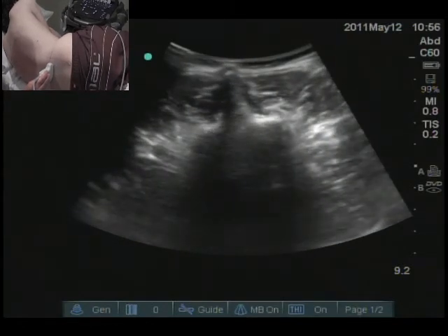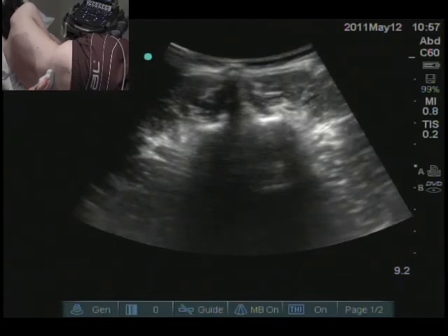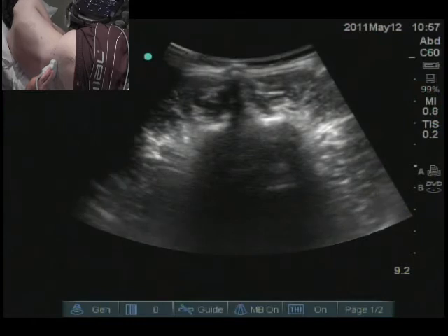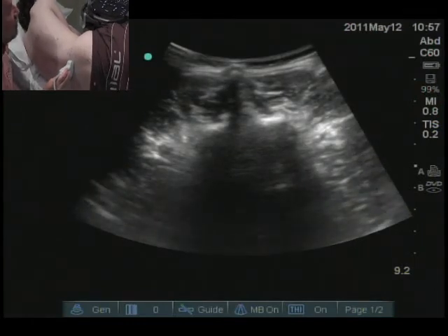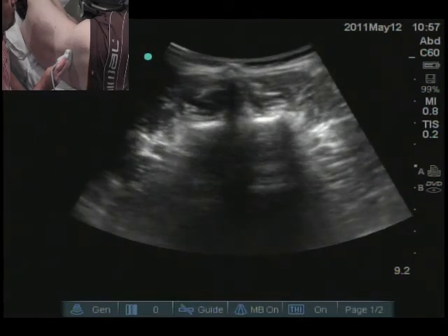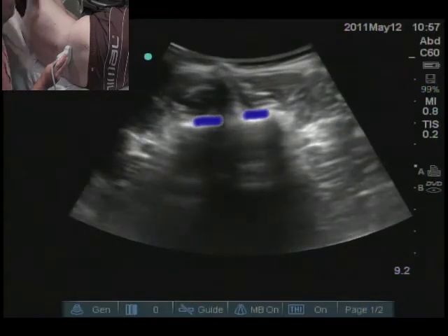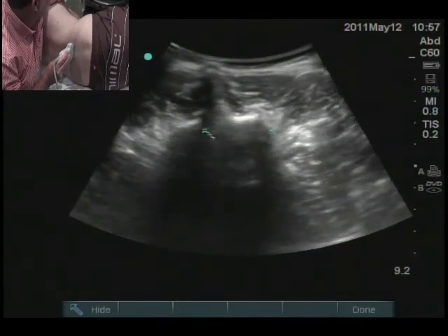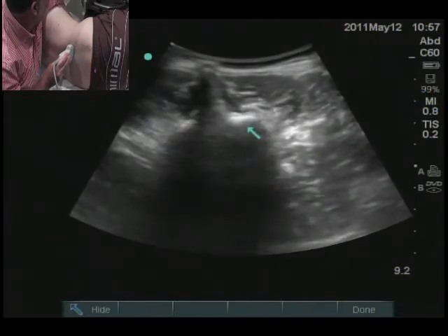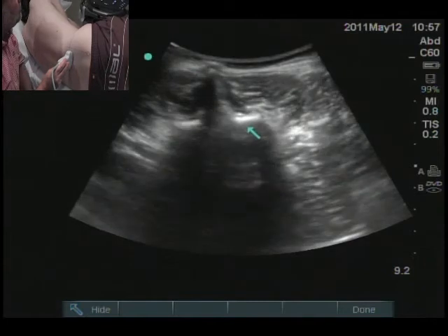So you know you're in the midline when you see that, or should we say, you know you're in the midline of that vertebra. If that vertebra is rotated, you may not be in the midline. Okay? And what we've got is a nice black dropout shadow, and you've got those two bright echoes. The first two bright echoes, what are they? If you go further laterally, the white line. What should be the dura? What's that there? That bright echo?